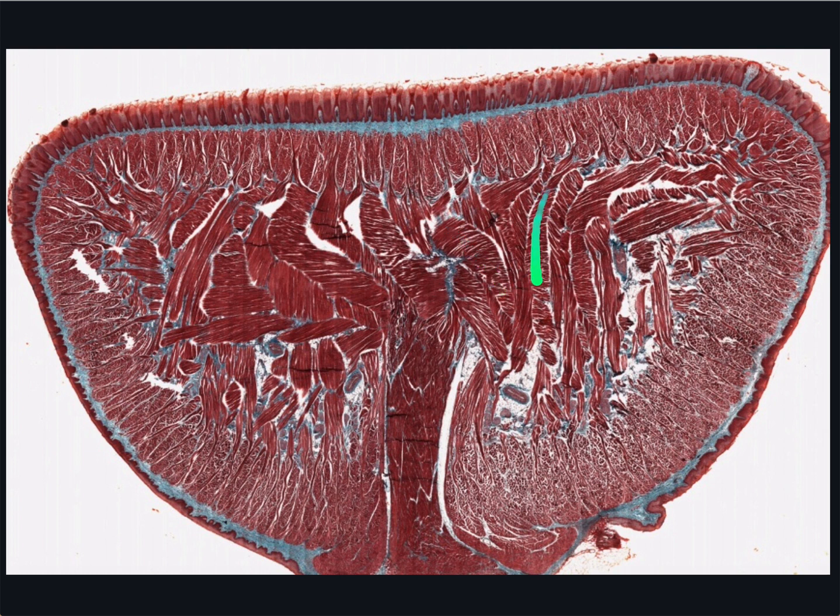In this lower region are small profiles of numerous nerve bundles needed to regulate this muscle activity. The Masson stain makes it easy to distinguish the epithelium from the underlying lamina propria.